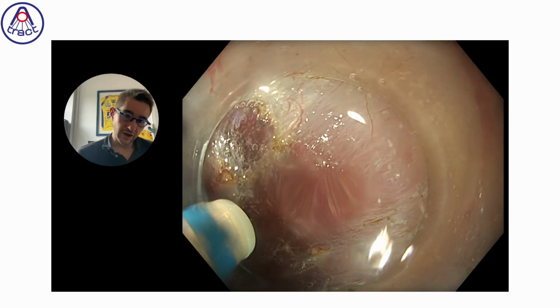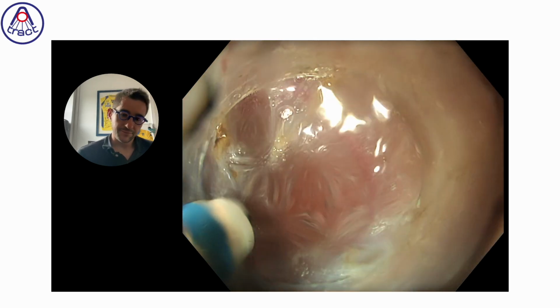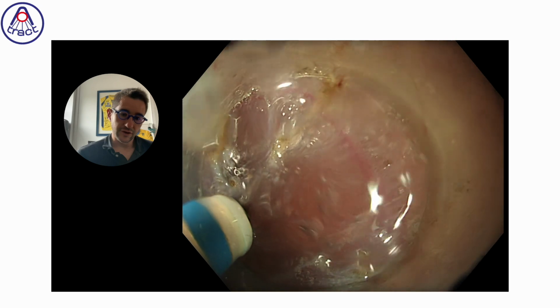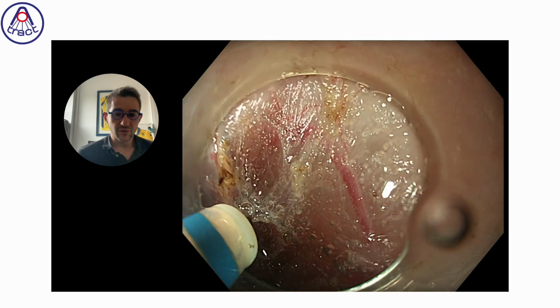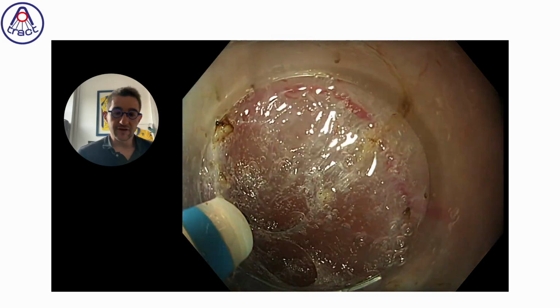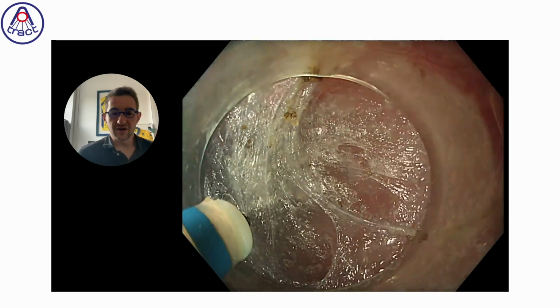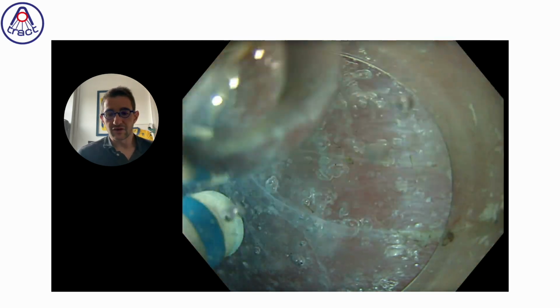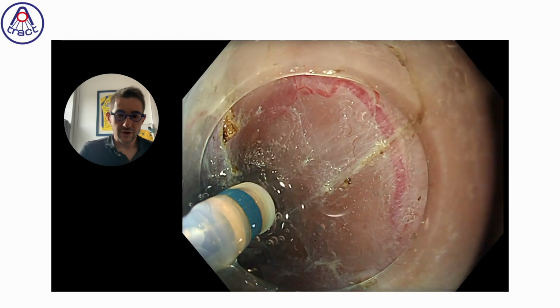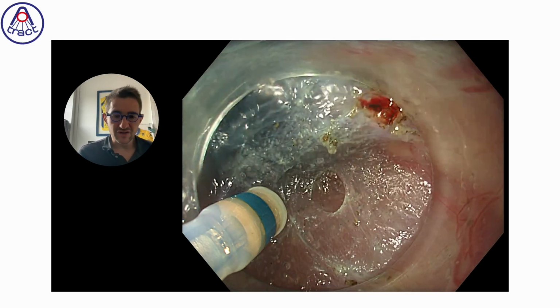Okay. You can sometimes face the muscle with the scope, because you control what you are doing. In the esophagus, we really try to protect the muscle as much as possible. Contact is not really a good idea if we can avoid it. So it is one organ where, yes, we want to be close to the muscle, but not touching it.